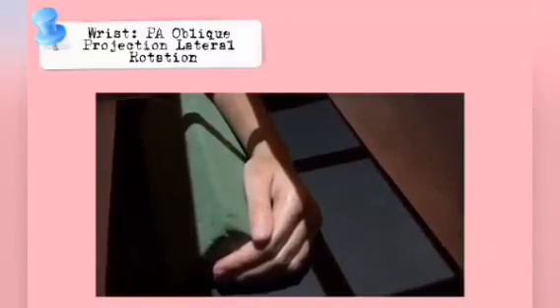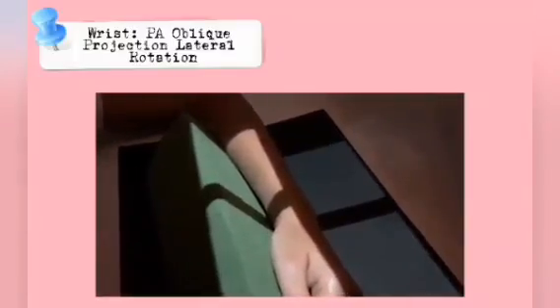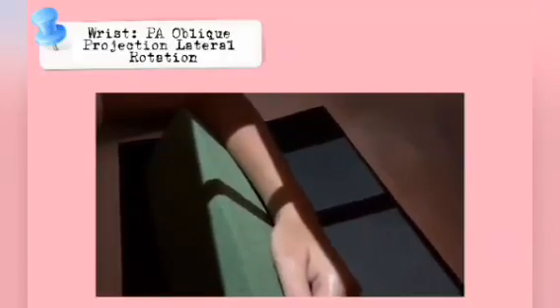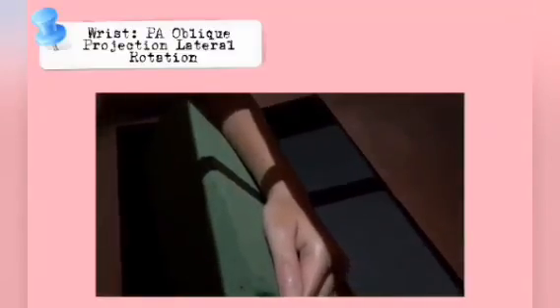For the exact positioning and to ensure duplication in follow-up examinations, place a 45-degree foam wedge under the elevated side of the wrist. Extend the wrist slightly, and if the digits do not touch the table, support them in place. When the scaphoid is under examination, adjust the wrist in ulnar deviation.